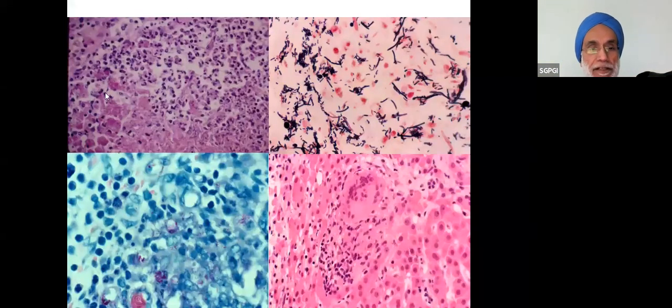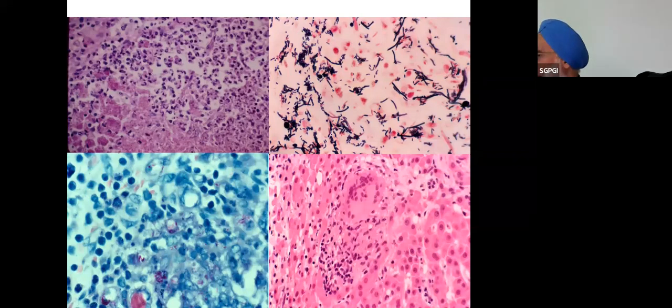Here's an example of an abscess formation within the liver. You should remember gram stains can be done on liver biopsies. They are not always useful. Sometimes the clinician already knows a culture is positive. Once in a while, they can demonstrate unusual organisms, such as Clostridia, such as bacteroides, and so you can come out looking like a hero. Oh, I made this diagnosis. You have to remember granulomas, you have to remember acid-fast bacilli in the right context.